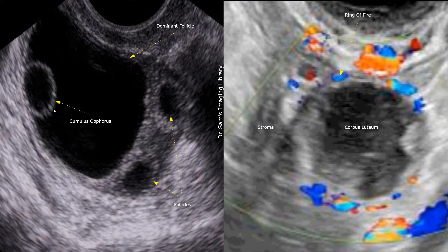This image shows a corpus luteum. It appears on ultrasound as a thick-walled structure with irregular-shaped walls. On color Doppler, it has a ring of fire, representing peripheral vascularity. It may have a cloudy or cystic center that can range from hypoechoic to hyperechoic, and is a normal finding following ovulation.